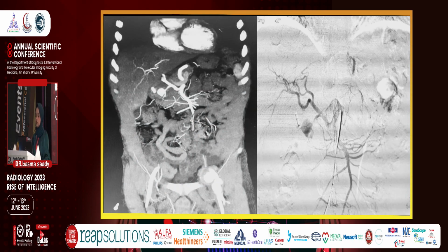This is a coronal image. Here we can see the common hepatic artery arising from the superior mesenteric artery and an abnormal structure, an aneurysm in the gastroduodenal artery. The patient was admitted into the IR unit, and through a very tiny femoral puncture and selective catheterization of the superior mesenteric artery, we can see that the common hepatic artery arises from the superior mesenteric and further divides into the hepatic artery proper and then the gastroduodenal artery.